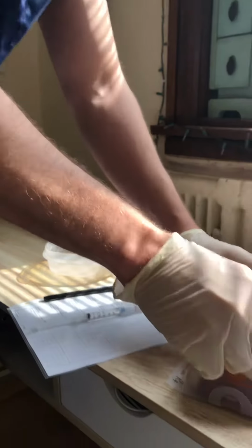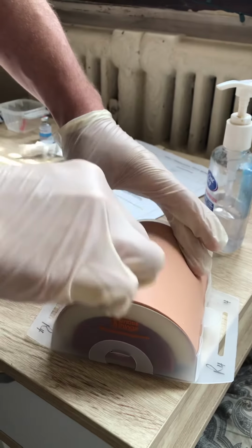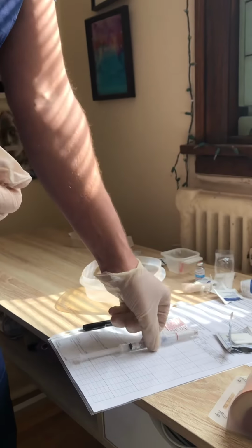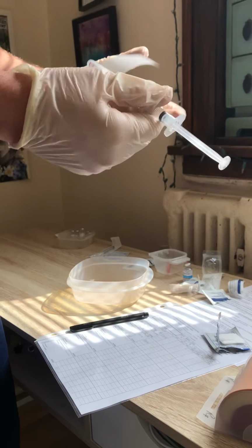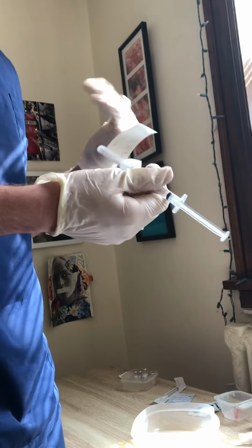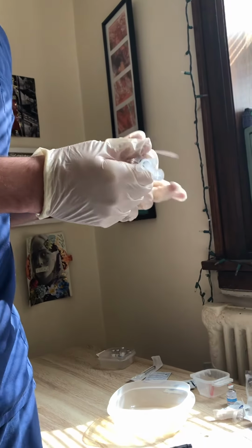So now I'm gonna clean the site in a circular motion for 30 seconds. We'll pretend that's been 30 seconds. I'm gonna leave that there just so I have an actual reference for myself. Also, it is important that in my facility, we do not aspirate when doing intramuscular injections, as per hospital policy.